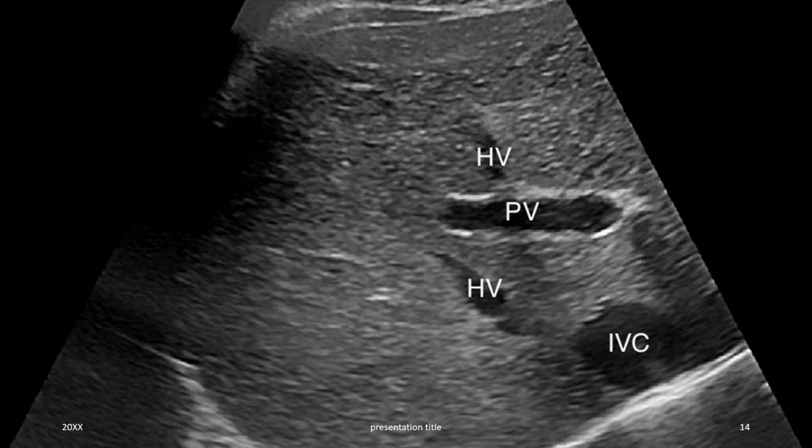Now here is an example, a little bit of what I was talking about. Here's a very full screen view of the liver, and you can see this echogenic border here indicates the portal vein. That is showing us that there was a significant change in impedance between liver parenchymal tissue and that portal vein capsule.